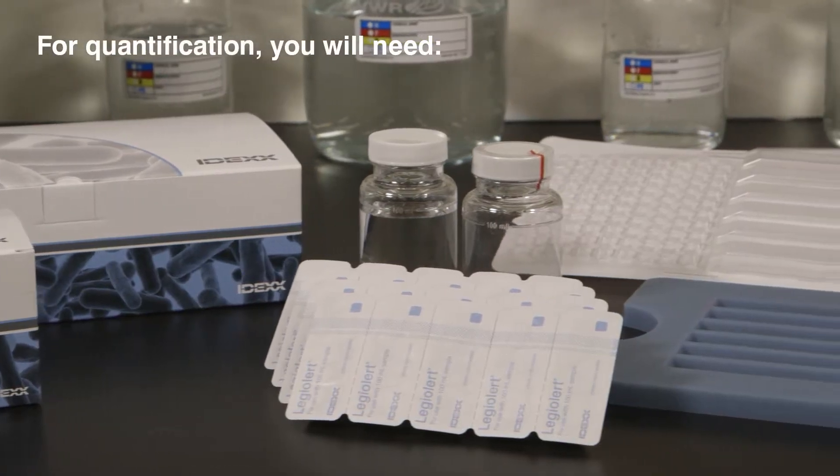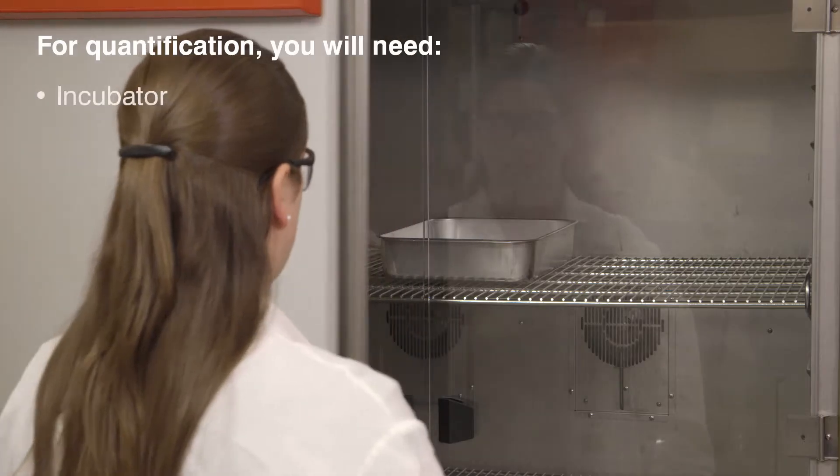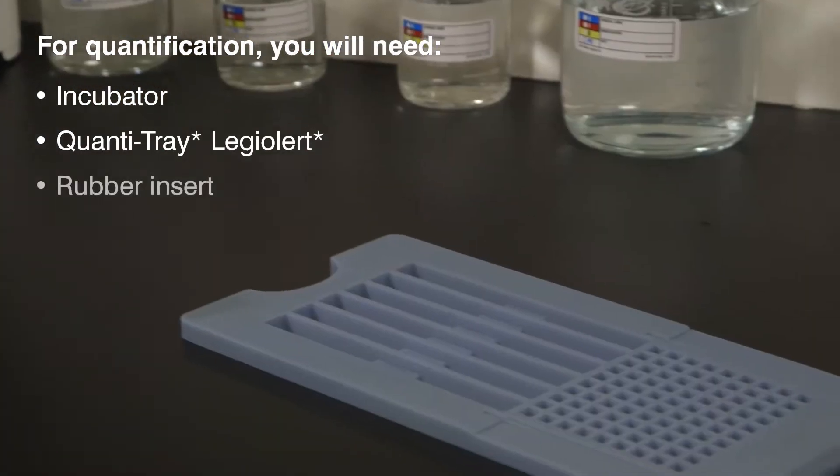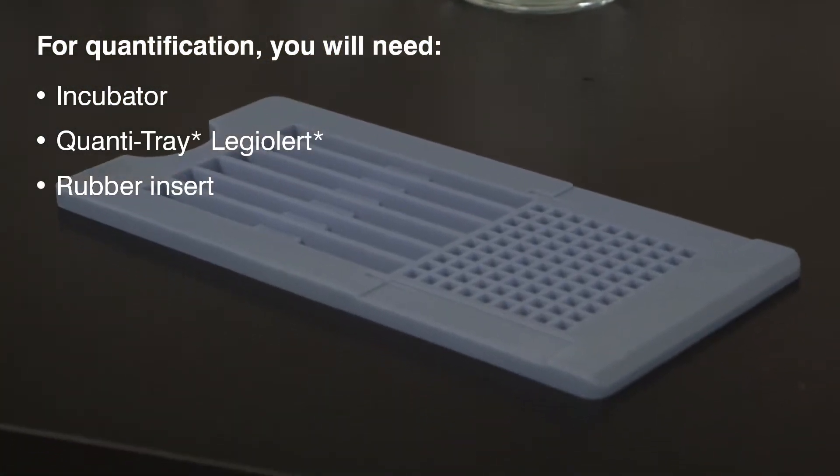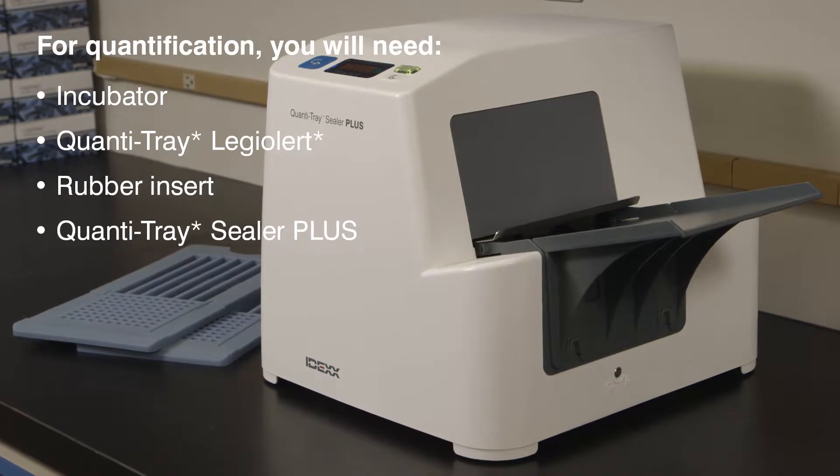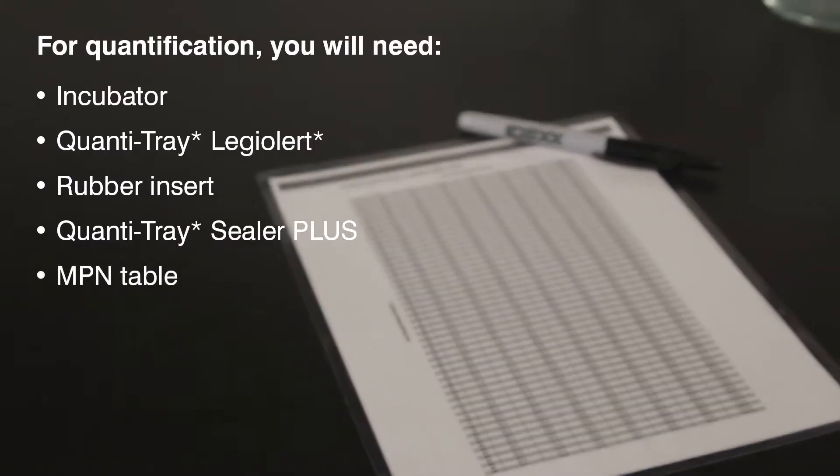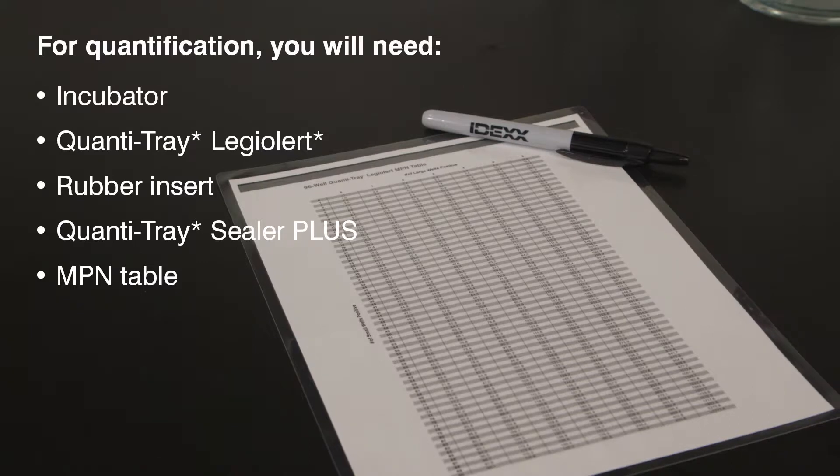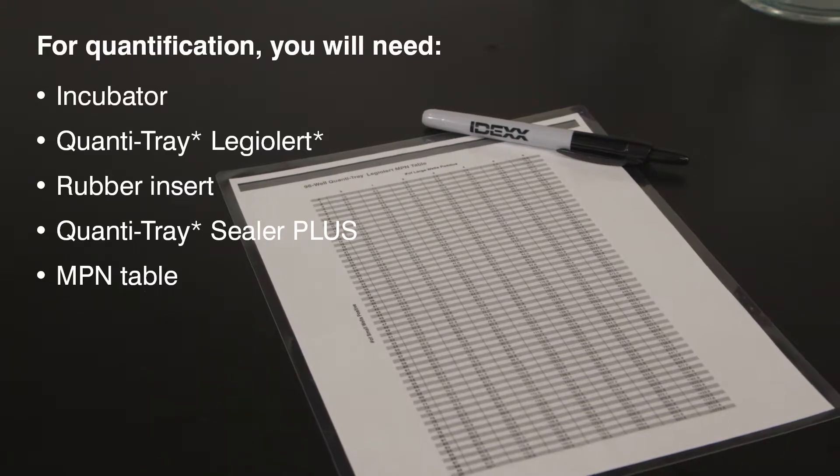For quantification, you will need an incubator, a QuantiTray LEG-ALERT rubber insert, a QuantiTray Sealer Plus, and the included most probable number table or the IDEX automated MPN generator program found at IDEX.com.